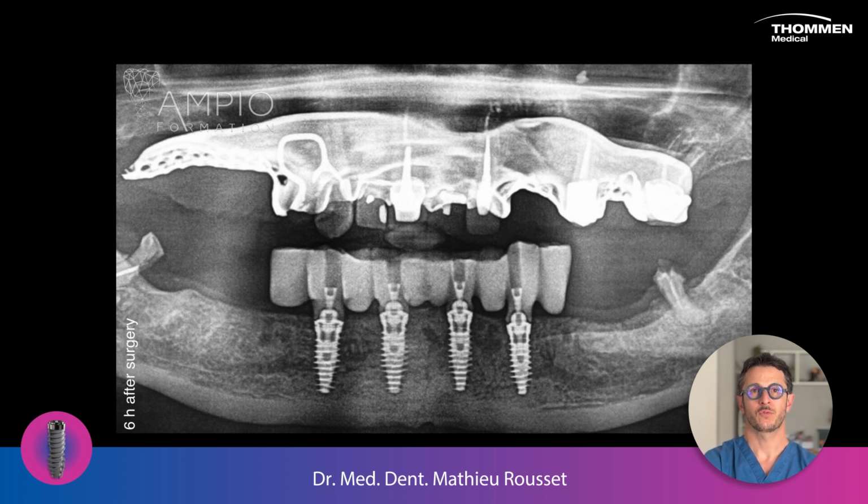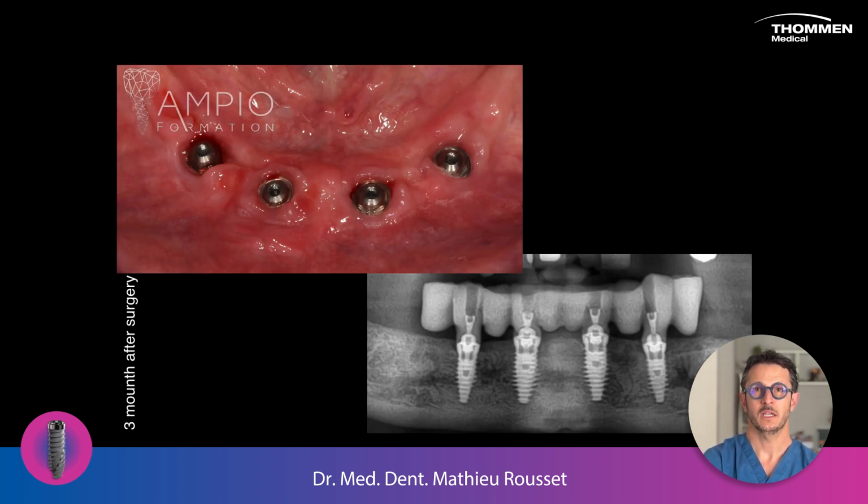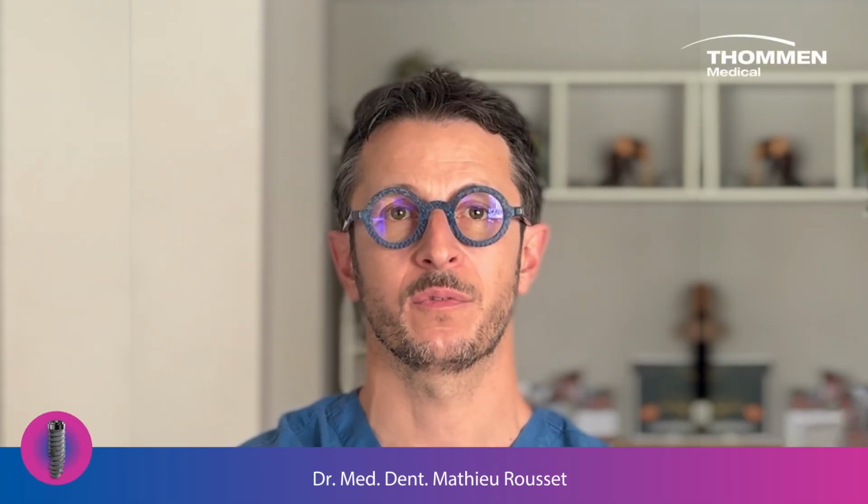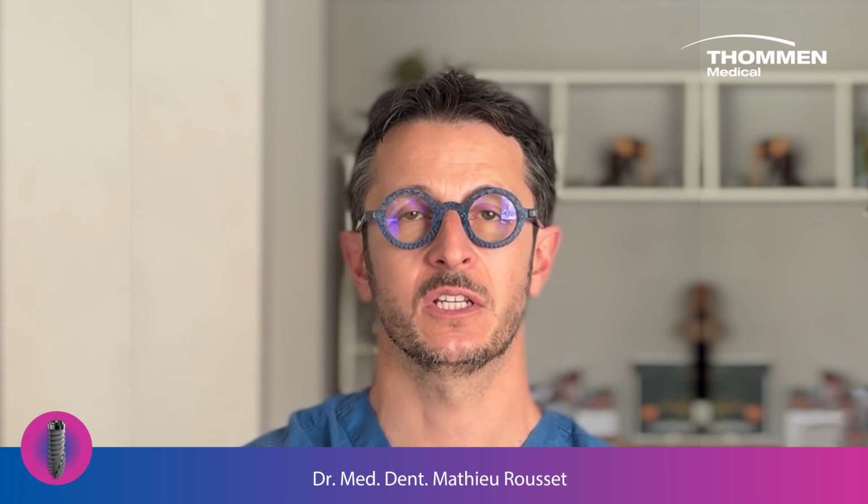At the healing control after 3 months, we can see ideal bone level that proves that despite the apparent aggressiveness of the implant, the Nevo makes it possible to increase the primary stability of the implant while respecting the surrounding bone. This implant meets all kinds of indications. It's really a gentle implant.